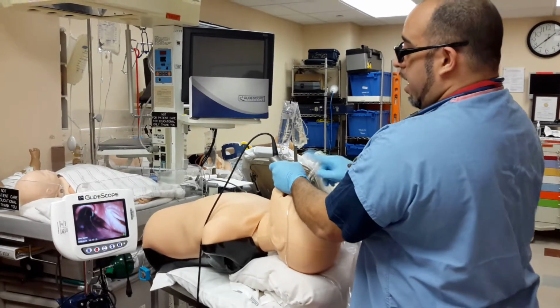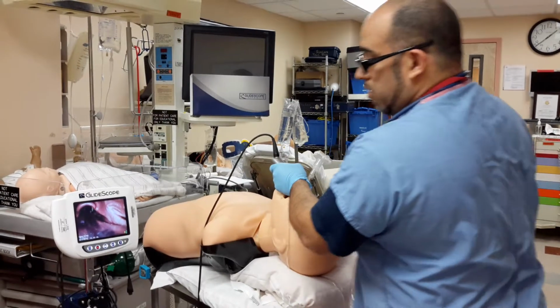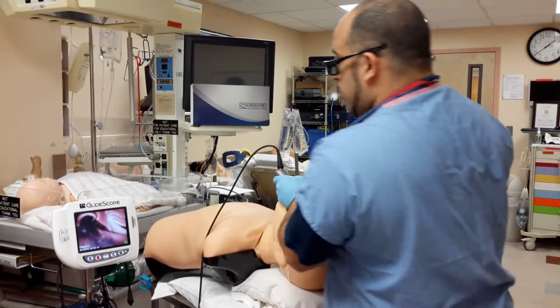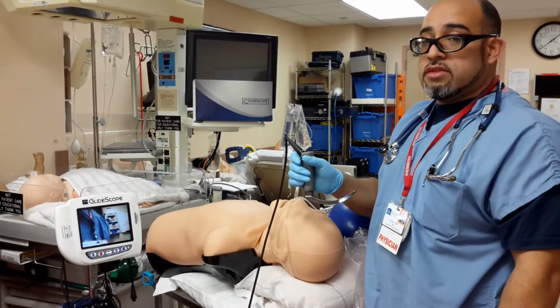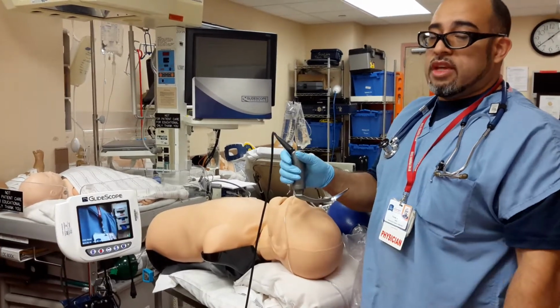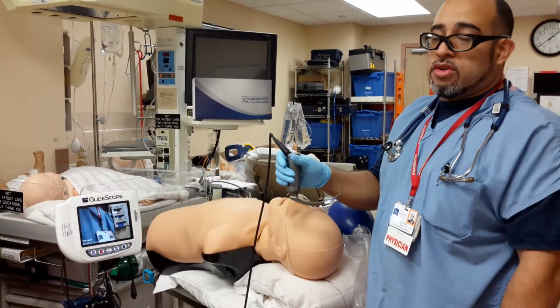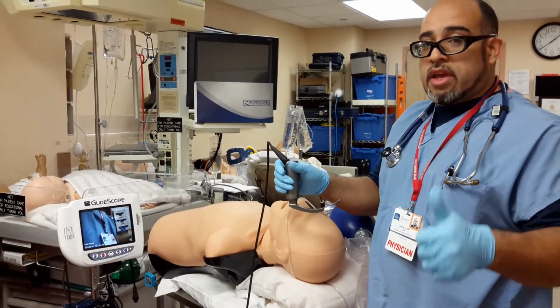You lift and at an angle. Use this as a vector, the handle, and this is what I see. Okay? It's designed as a Mac, not as a Miller. Remember those things, and this product will be very successful in your hands, and you will do no patient harm. Okay? It's all about the patient safety, and later on, the ego and the high fives once you've successfully intubated the patient. Now you got to figure out why the patient is short of breath and deal with all the other problems the patient has. Okay? Thank you.